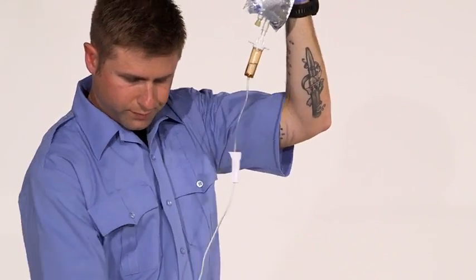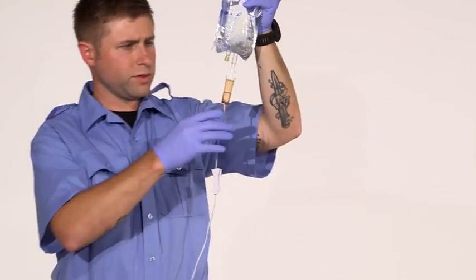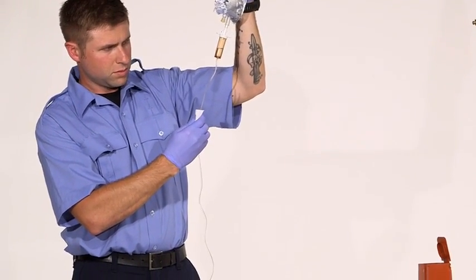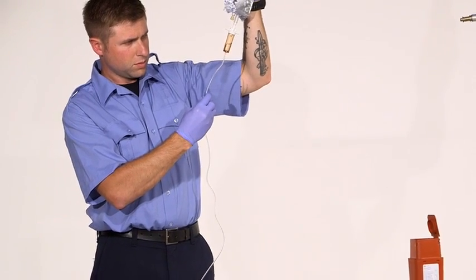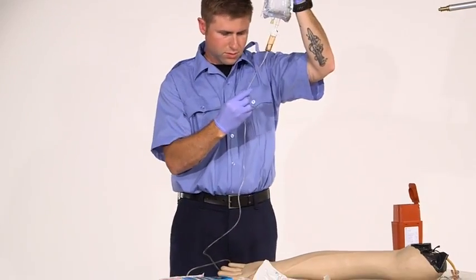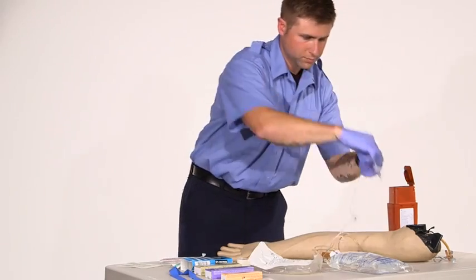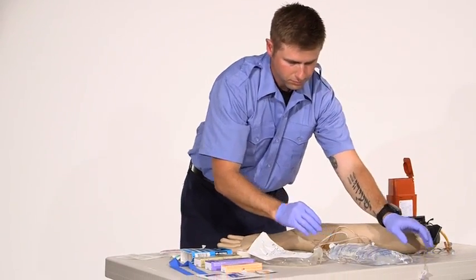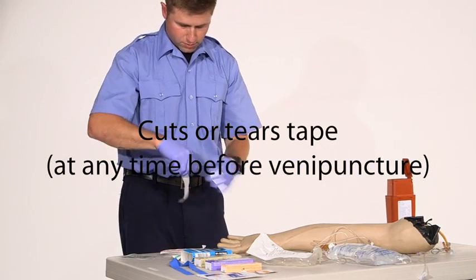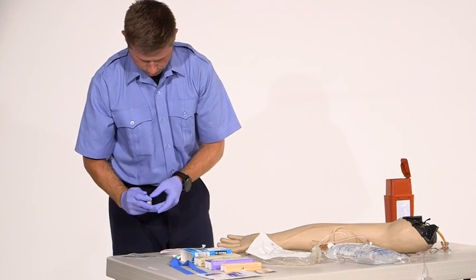I'm going to set my line over, make sure I get all the air out of my line. All the air is out. Excellent. I'm going to cut, at this point, some tape. That's ready.